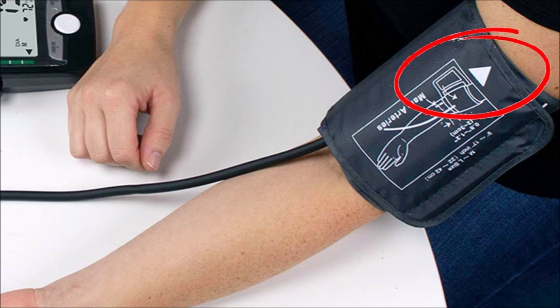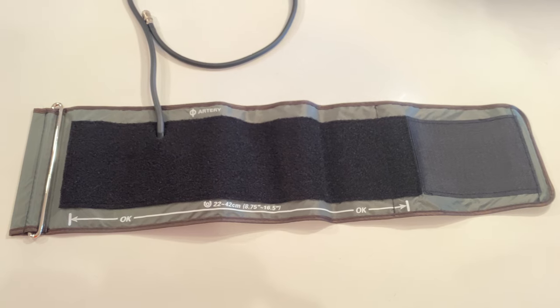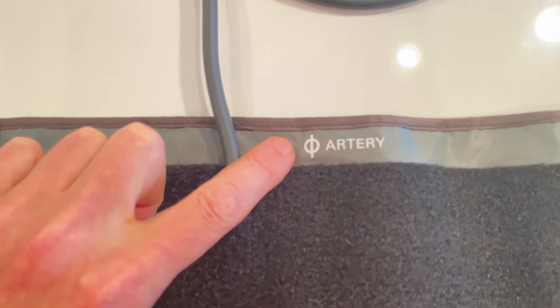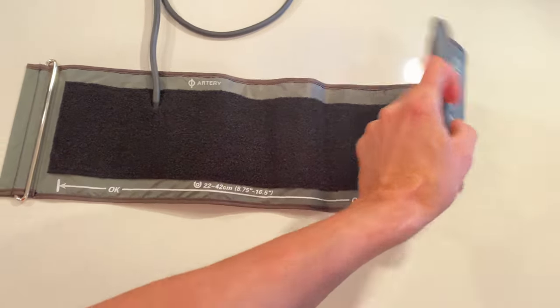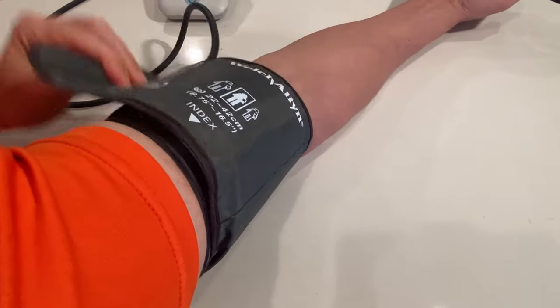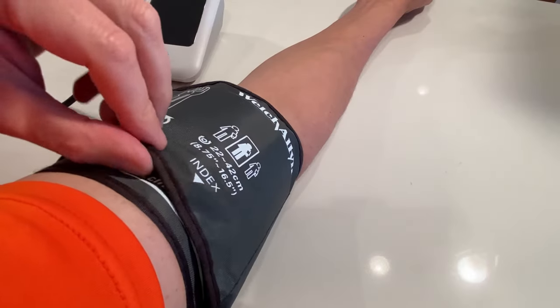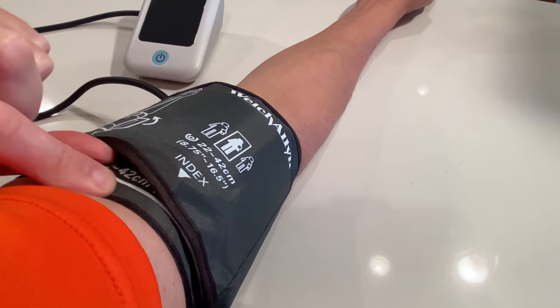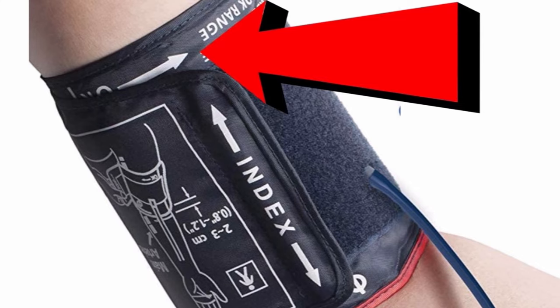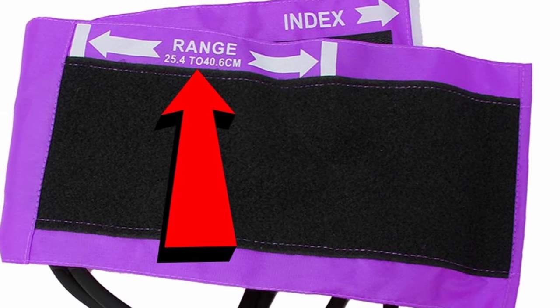The next scenario is when the cuff doesn't use an arrow as an artery marker, like with my Welch Allyn 1700 cuff. Instead, they use another symbol. This style cuff has an arrow on the other side of the cuff, and when the cuff is secured correctly, the arrow will point towards your shoulder and the cuff size range index line.